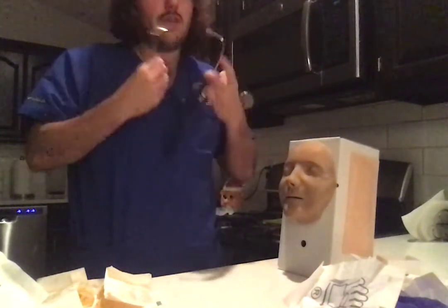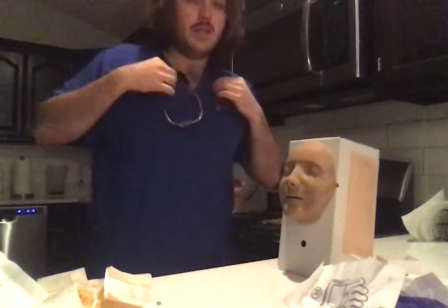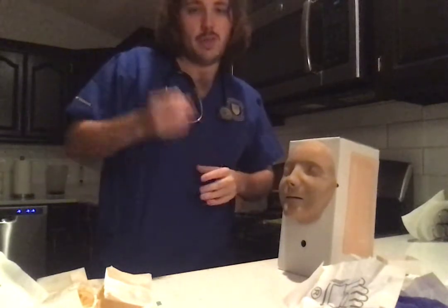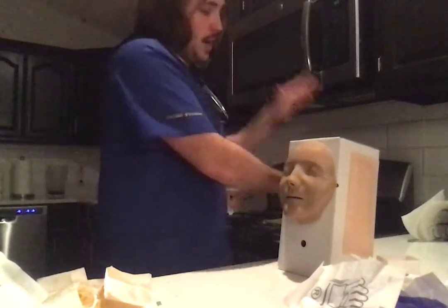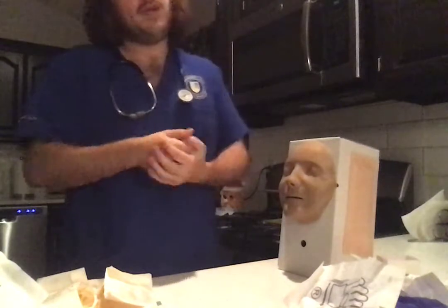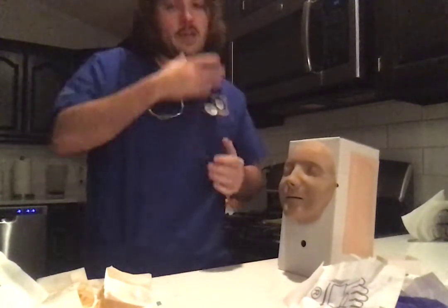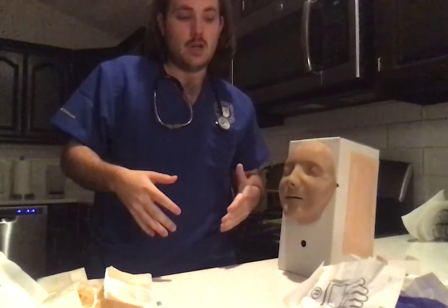Once we've auscultated the lungs, we would then increase the supplemental oxygen to Mr. Laerdal. He's going to be experiencing a little irritation due to us placing this tube through his trachea. We would perform hand hygiene. We would place our PPE on, which for this case will be a face mask and eye protection of some sort like goggles, and then we would place all of our supplies out.